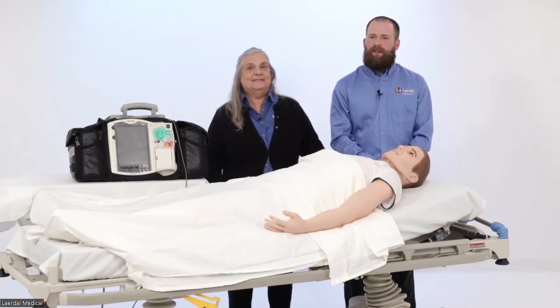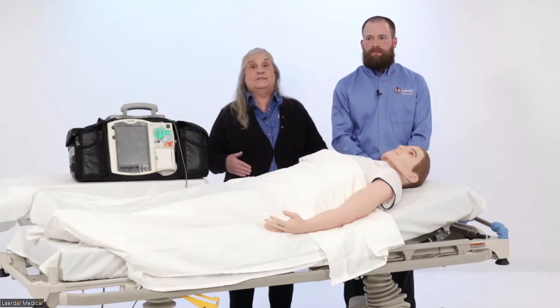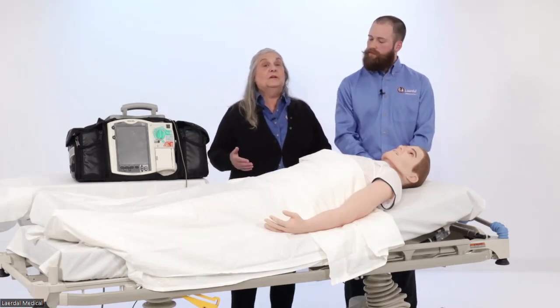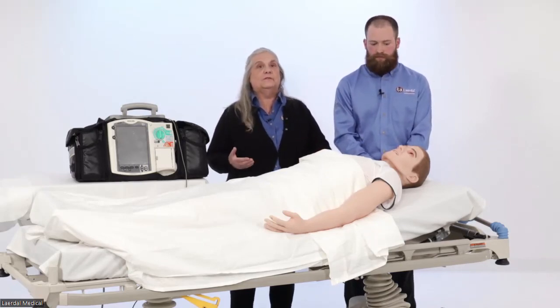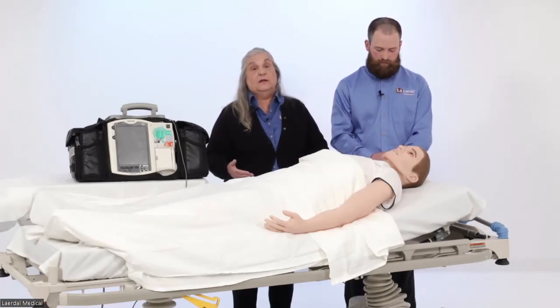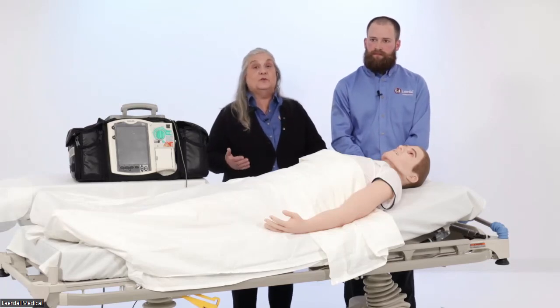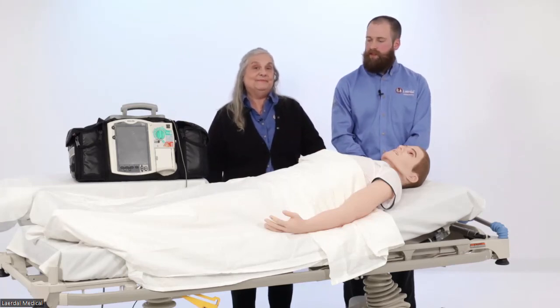Another question I see: one layer of painted Tegaderm for moulage, will there be an issue with it sticking to the skin? The one nice thing about the silicone skin is it is realistic, but it also doesn't have too much stickiness to it. So if you do have any kind of an adhesive, it won't stick as much. The other side of that is you will sometimes have to use a double-sided gel that we sell with him to stick certain types of moulage onto him. Excellent. Thanks so much, Meg.